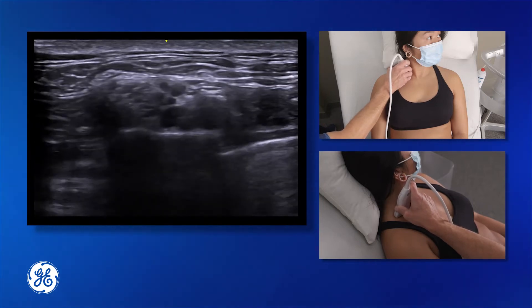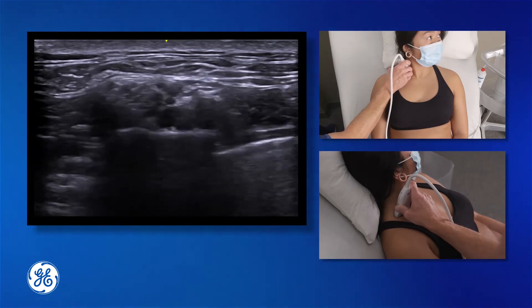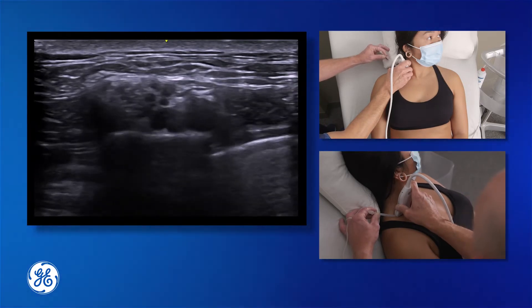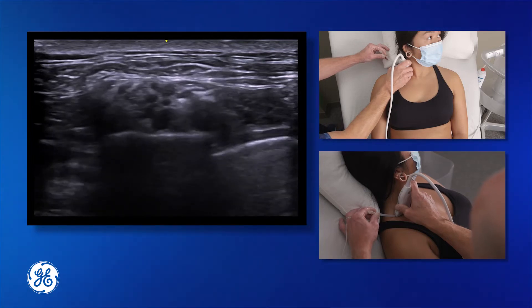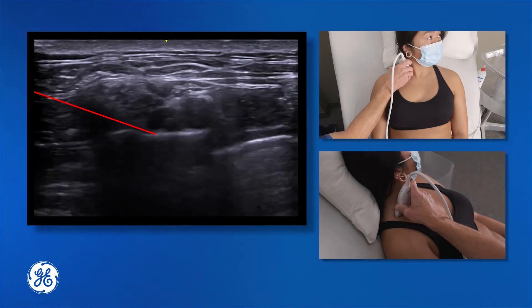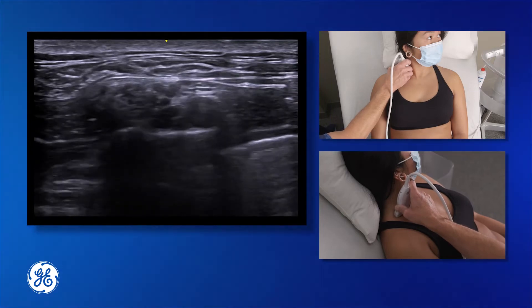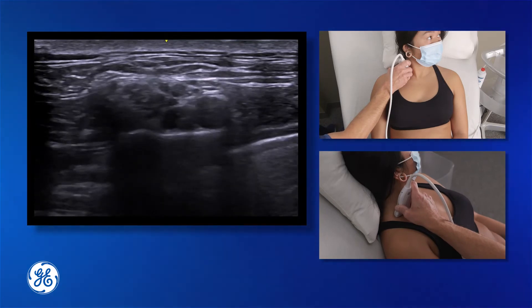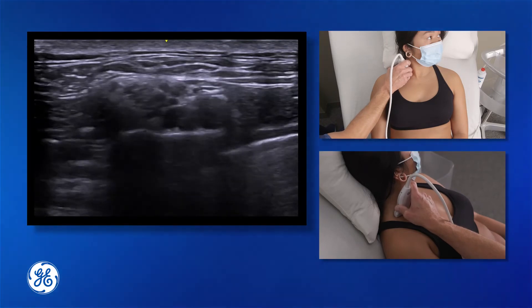Once we've got all of these structures together in a nice uniform shape, we're going to approach our needle from the posterior side of the probe, coming in from the lateral side — the right-hand side of the screen. We want to position our needle down in what we call the eight-ball pocket, above the first rib next to the artery. The C8 and T1 branches sit down there, and quite often those are the areas missed with this nerve block, where people really don't want to put the needle deep down to the plexus.